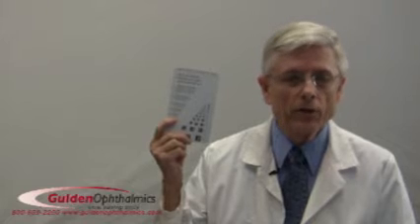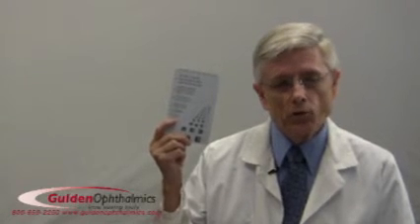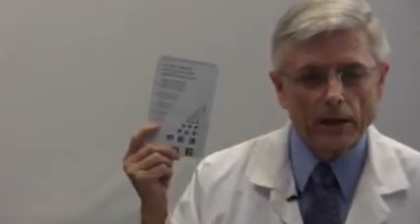The reading card is designed using principles similar to those used for the Minnesota Low Vision Reading Test, or MN-Read. Thus, this card can be used to obtain a quick and accurate assessment of a low vision patient's reading speed. There's a tumbling E chart on the other end of this card that you can use for children and illiterates.